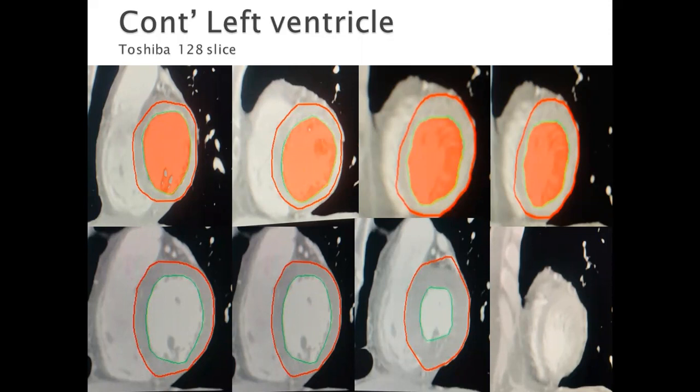So you get multiple segments, and then you are going to select on the machine the part that shows inner wall and outer wall. So you're going to outline the inner part of the wall of each of the slices that you get. So let's start from the bottom on my right. This one, you don't want to use this because you can't really see a proper chamber here. But here you can see a proper chamber. So you outline the inner part, and the outer part, you outline the wall.